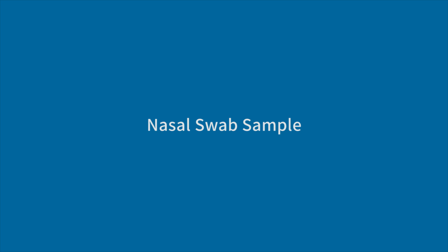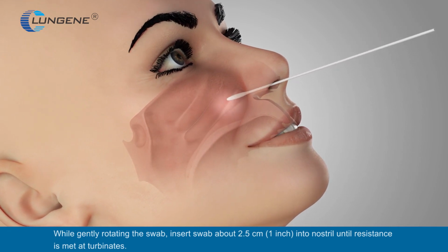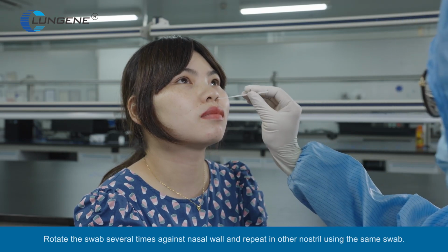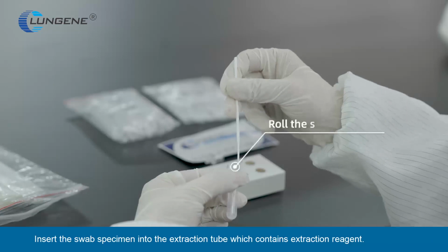Nasal swab sample. While gently rotating the swab, insert swab about 2.5 cm (1 inch) into nostril until resistance is met at the turbinates. Rotate the swab several times against the nasal wall and repeat in other nostril using the same swab. Insert the swab specimen into the extraction tube, which contains extraction reagent.